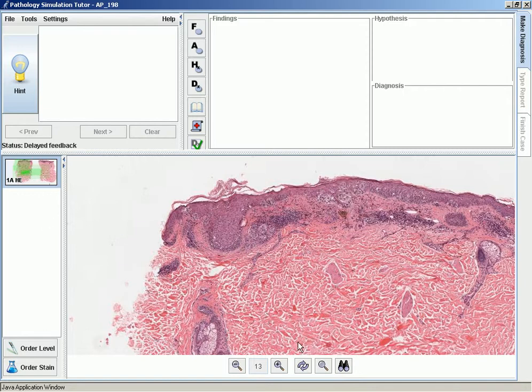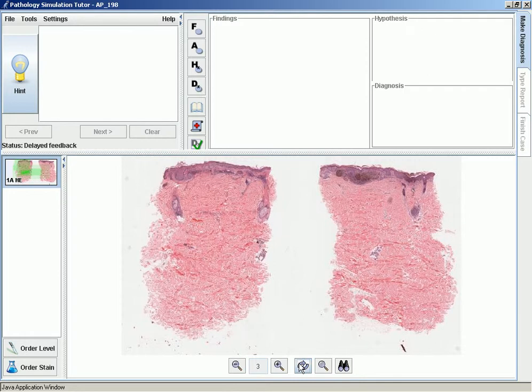The next button down here is the refresh button or reset button, which returns the slide to the whole slide view. So to do that, simply click the refresh button. You can also use the reset button if the viewer is not refreshing. Sometimes resetting the viewer helps.